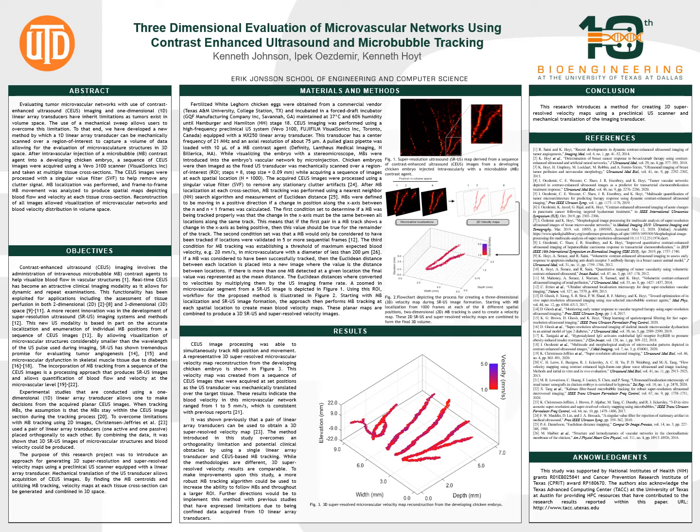The data was processed initially with a singular value filter to remove any stationary clutter artifacts, and localization was performed to define the microbubble centroids. Velocity maps at each tissue cross-section were created by validating microbubble locations through a nearest neighbor search with 3 criteria.